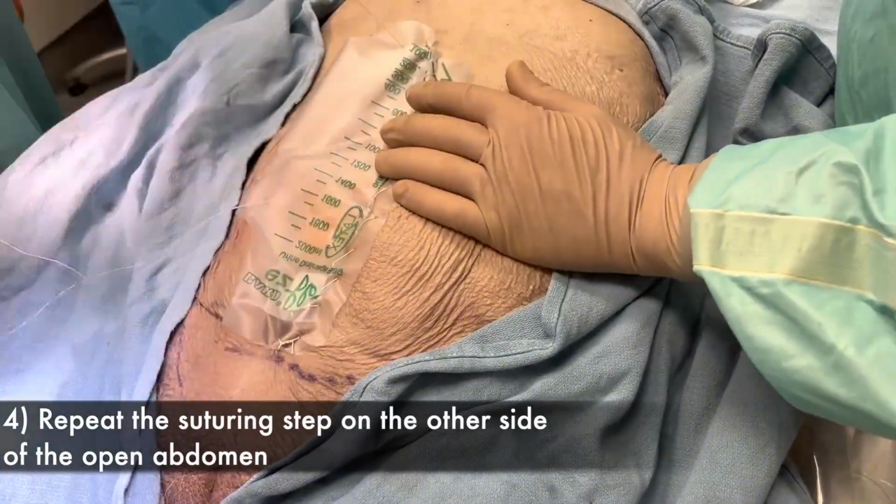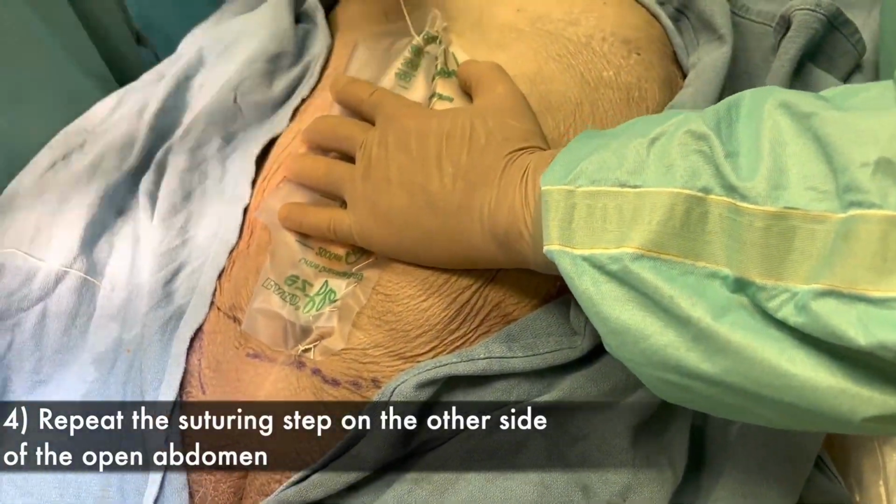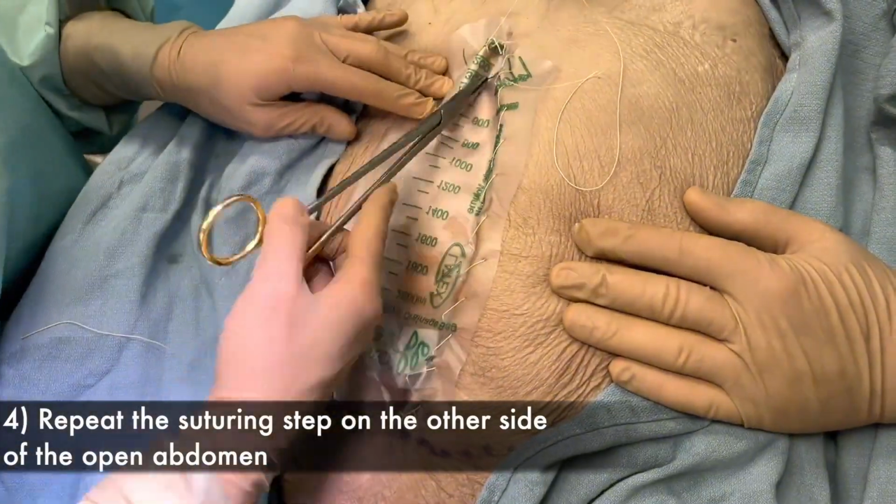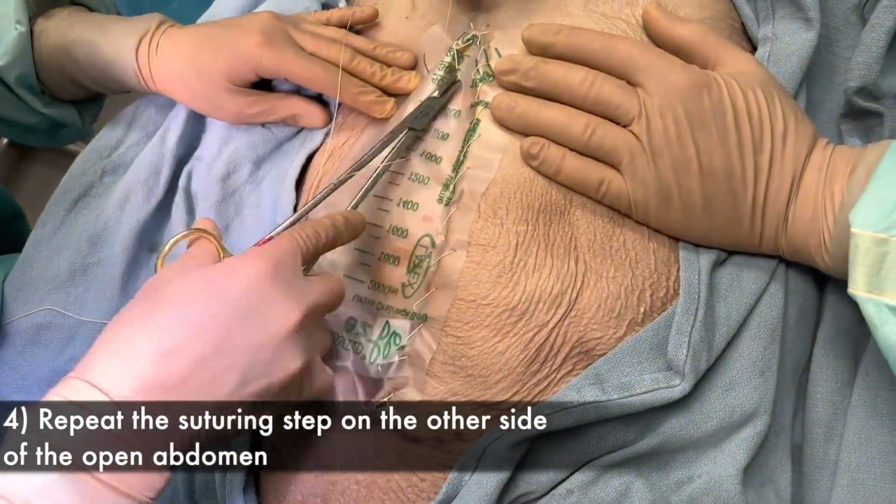Repeat the same suturing steps as previously described on the other edge of the wound. However, this time start suturing at the upper end of the open abdomen and perform running sutures towards the lower end of the wound.